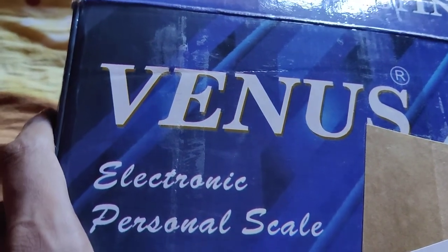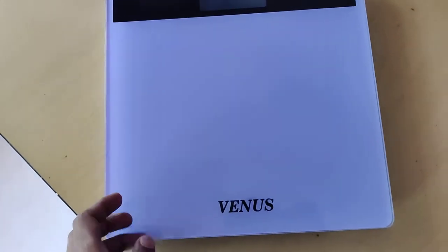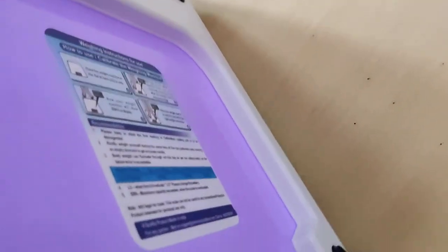The device in my hand is a Venus electronic personal scale. In today's video, we are showing how to insert or remove the battery in this scale machine. For doing this, you must turn the backside of your machine.